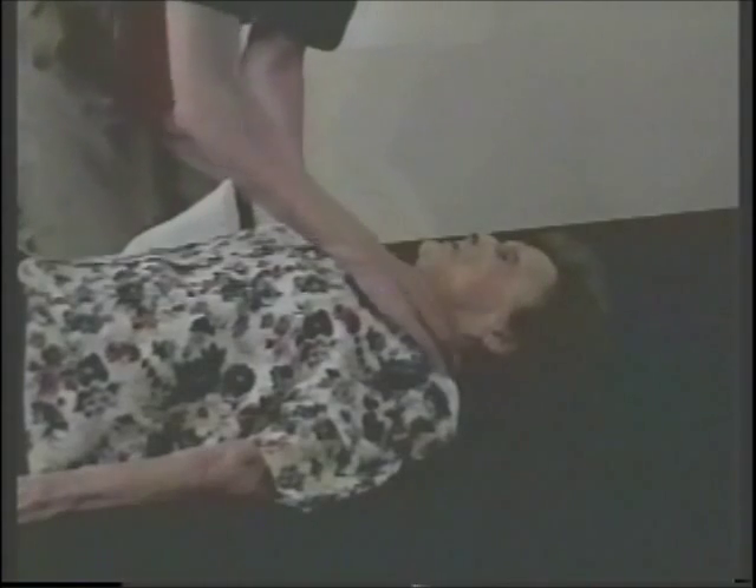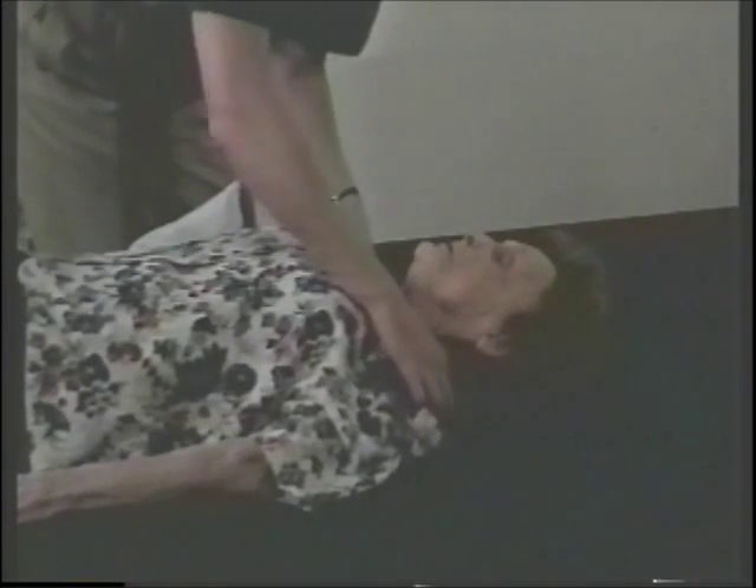Her neck is nice and flexible and mobile. Let's look at your shoulders — they're nice and relaxed. So we don't have any fixed contractures. I'm just going to replace the pillow for comfort.